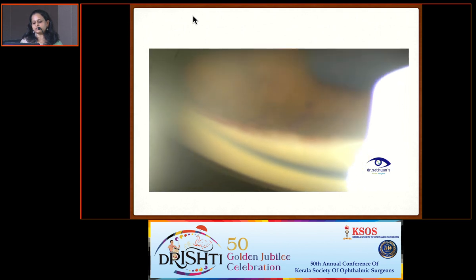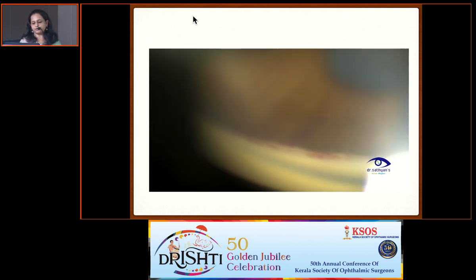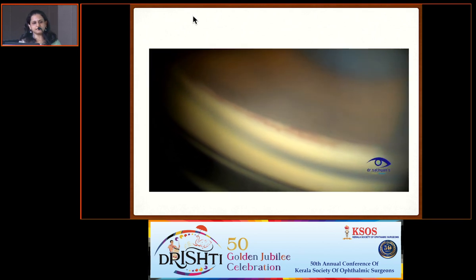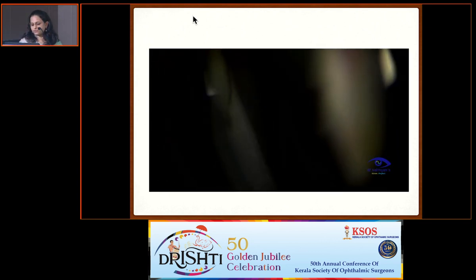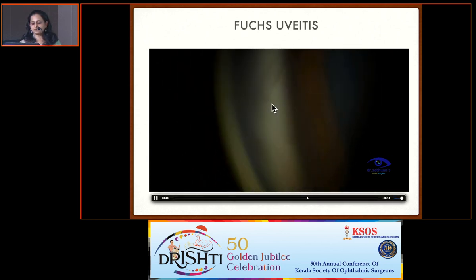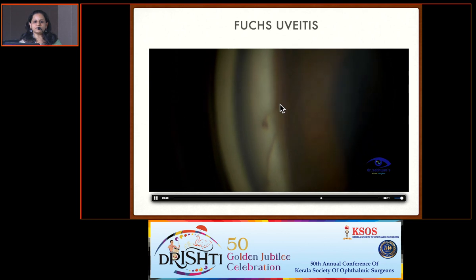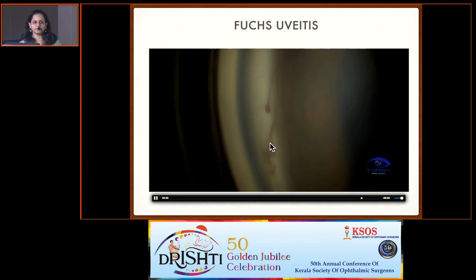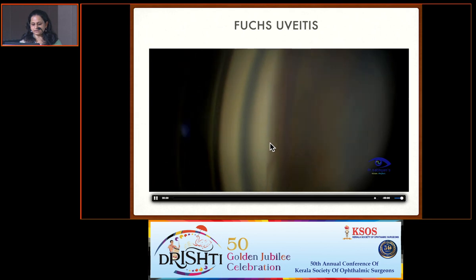This was a video of a patient who came to us for cataract evaluation. On examination, the cornea had stellate KPs on the endothelium. On doing gonioscopy, you can see that the angle had fine vessels, which actually started bleeding. So this is a case of Fuchs uveitis. The patient's IOP was normal. You can see the active blood that is coming here. So in Fuchs, you will have very thin vessels in the angles, which will bleed on gonioscopy, or can also bleed on the table when you're doing the cataract surgery. Once the IOP comes down, you will have bleeding from the angle.